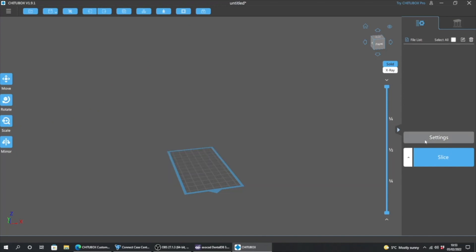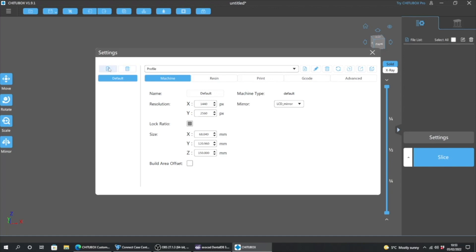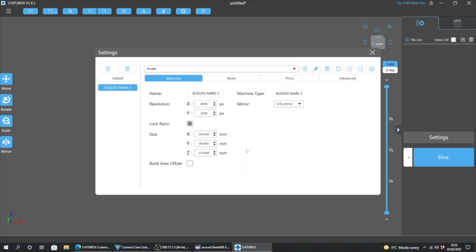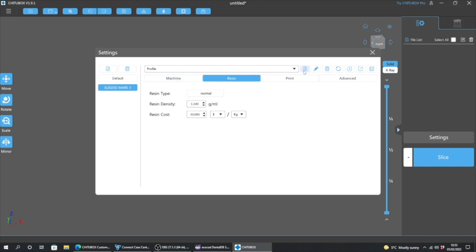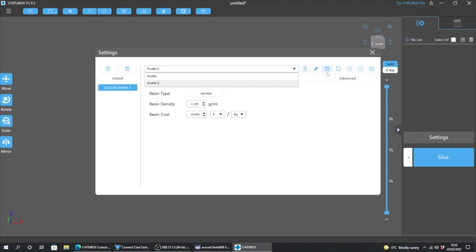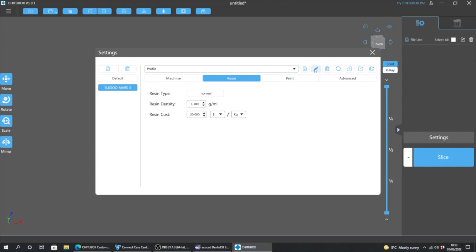This is a brand new setup of the software that I've just done, so there's nothing previously loaded on it. First of all, click on Settings and then go and choose your printer — this is the Elegoo Mars 3. In the profile, just click on the little pin button there and then you can edit the profile settings or save a specific setting for the resin that you want to use.